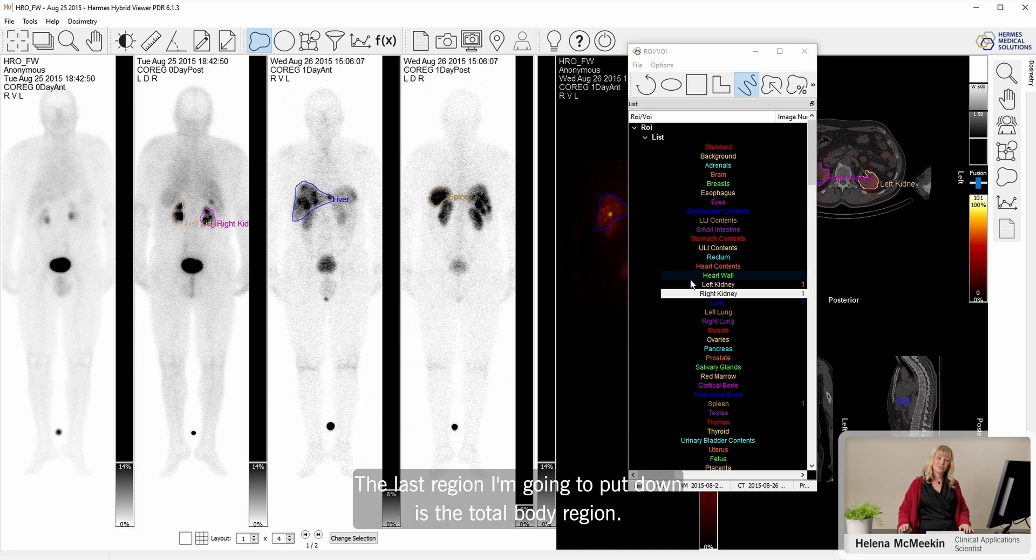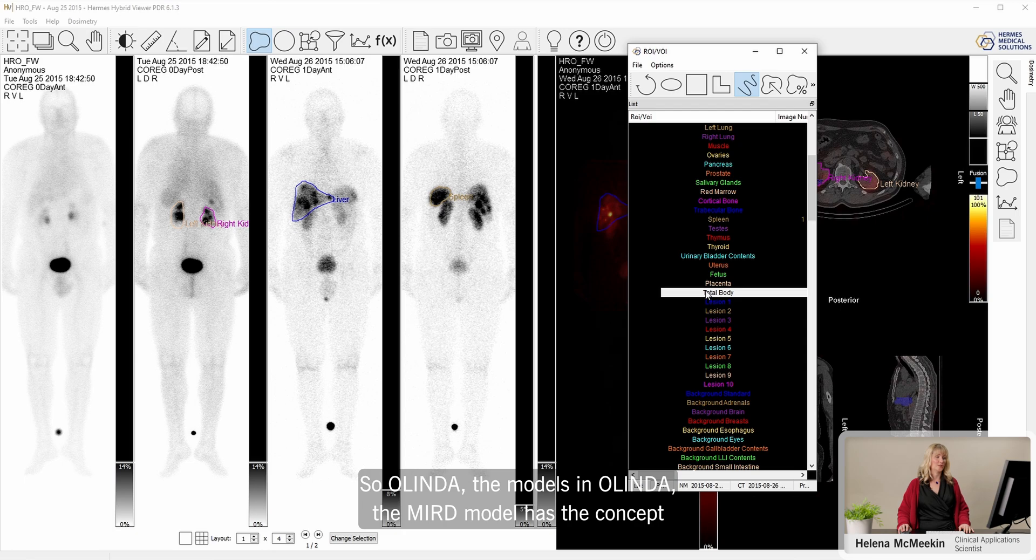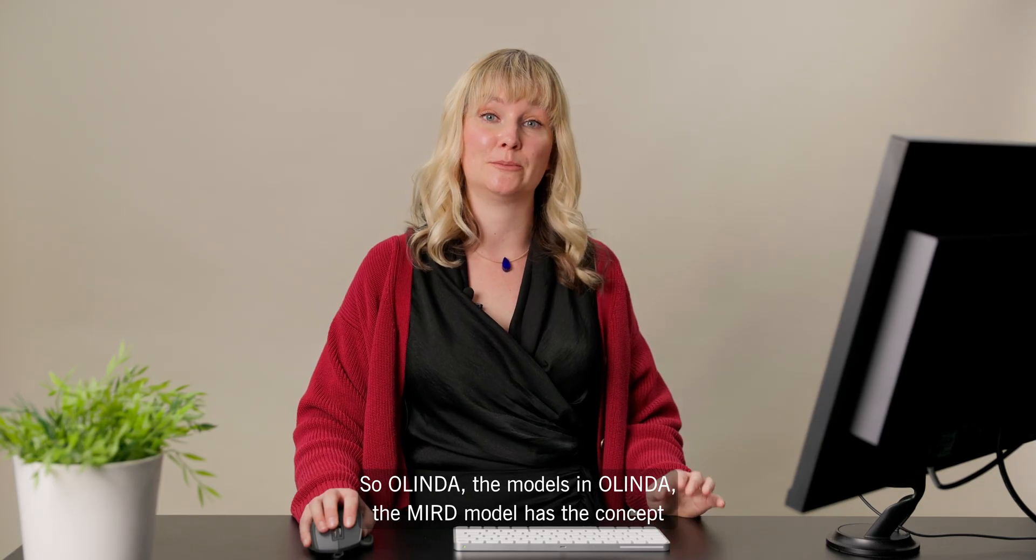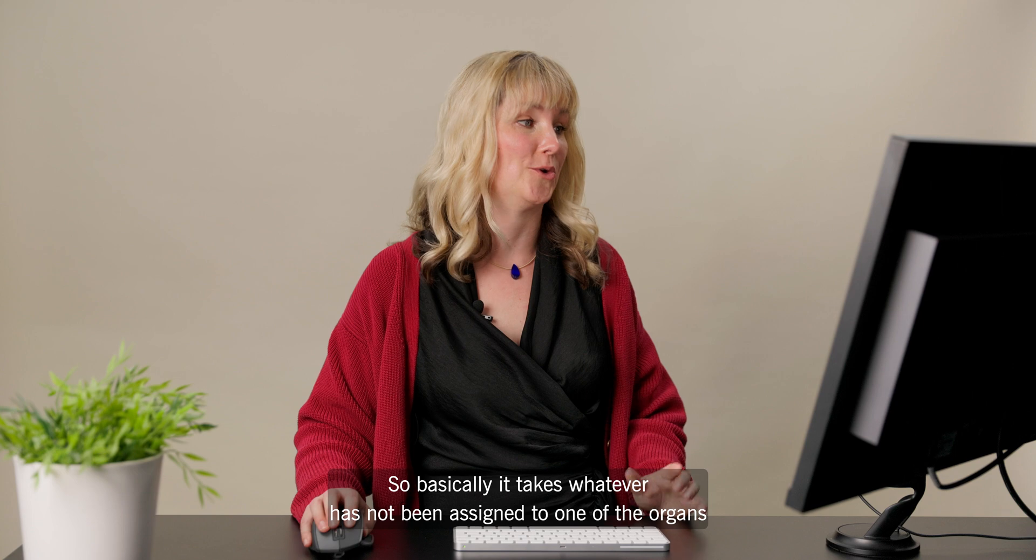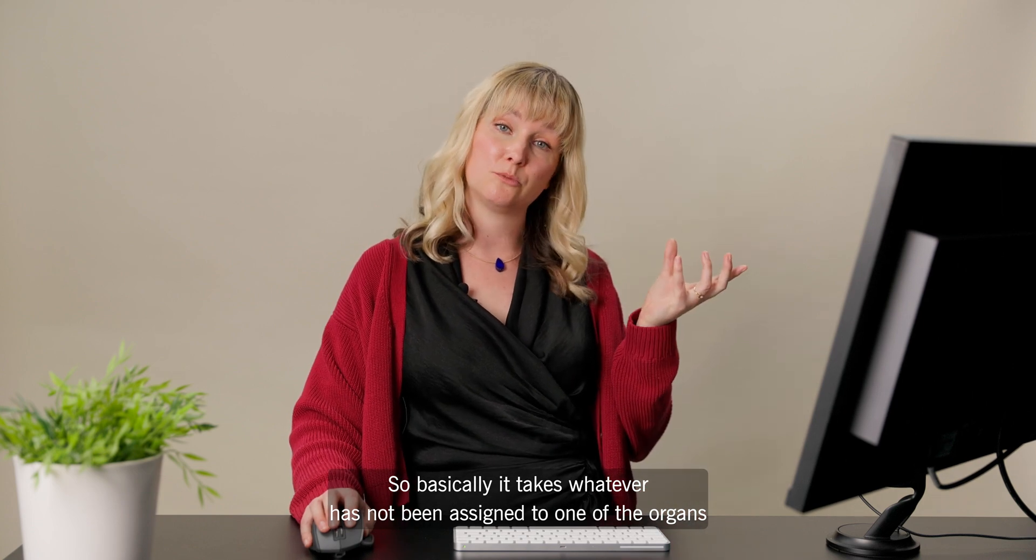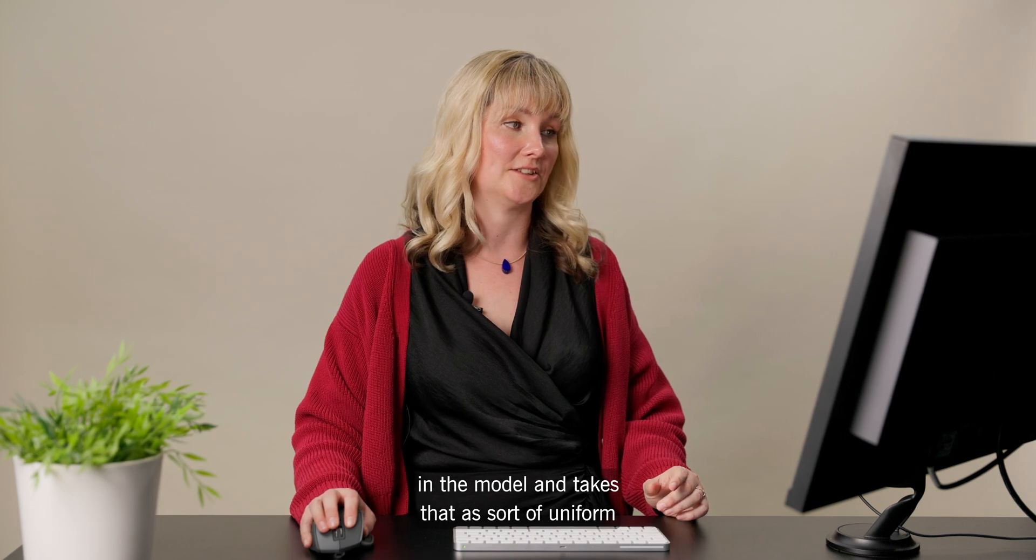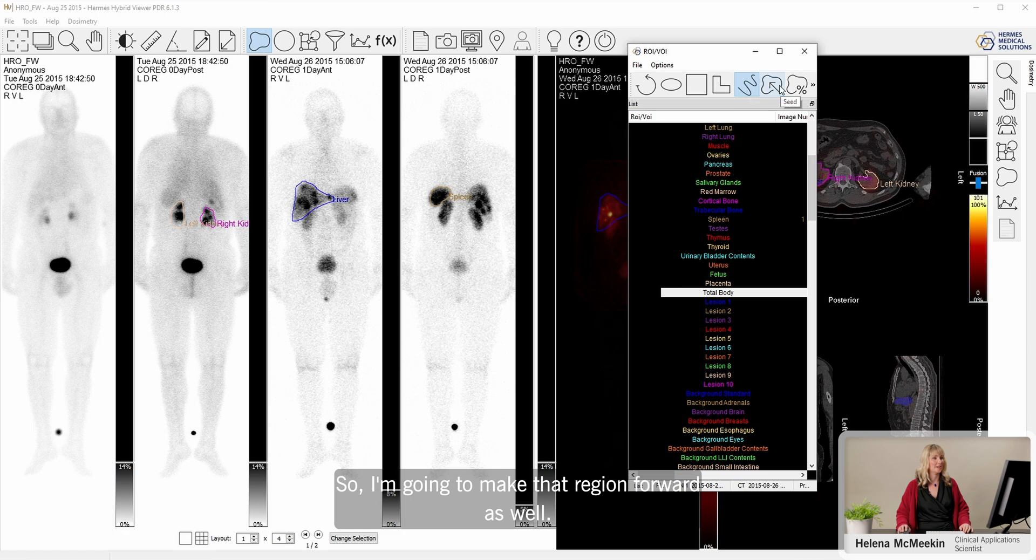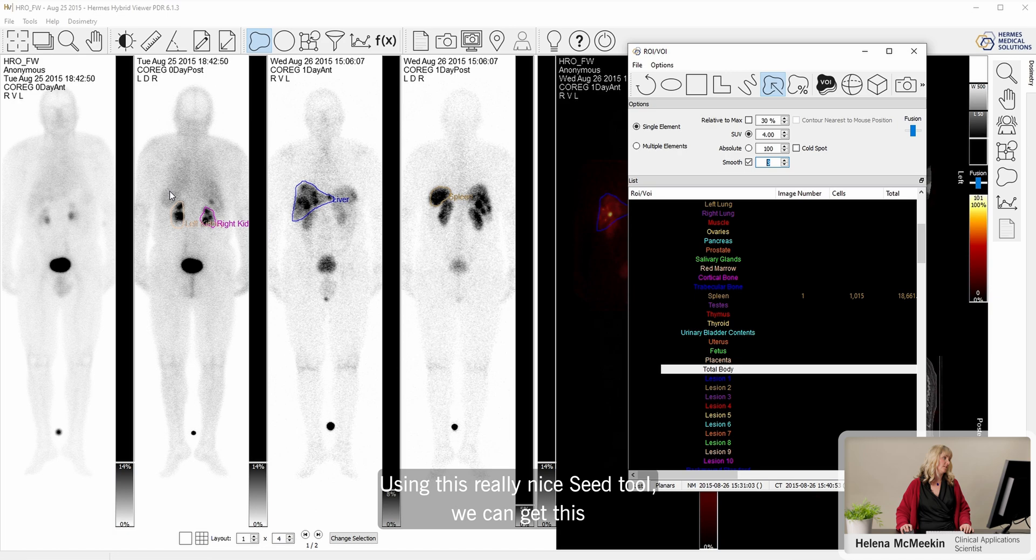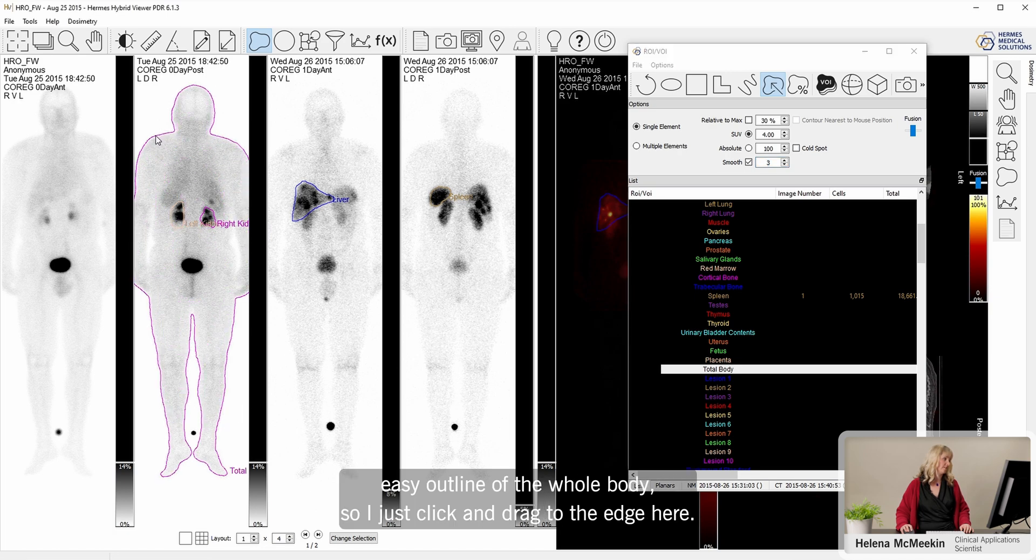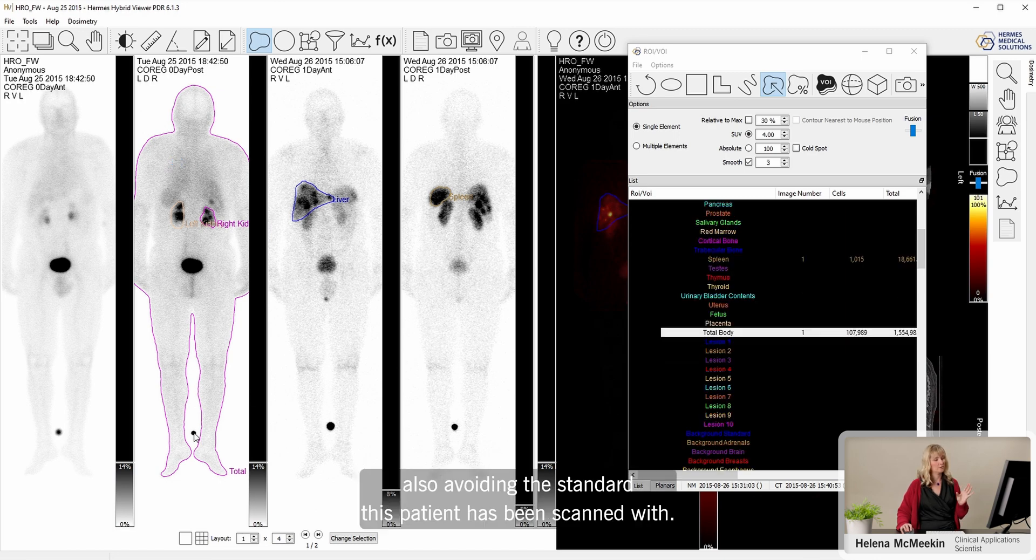The last region I'm going to put down is the total body region. So the MIRD model in Olinda has the concept of the remainder organ. It takes whatever has not been assigned to one of the organs in the model and takes that as the uniform irradiation of the whole body. Using this seed tool, we can get this easy outline of the whole body. I just click and drag to the edge here, and it really nicely defines that whole patient, also avoiding the standard that the patient has been scanned with.